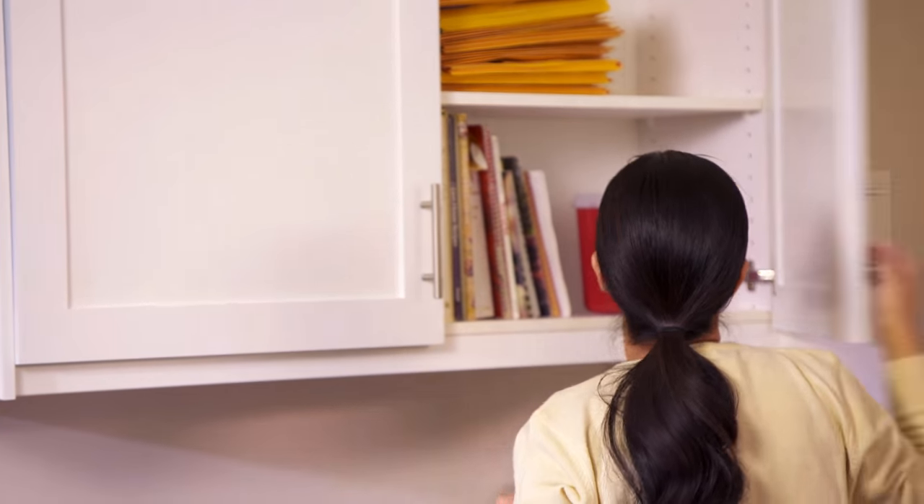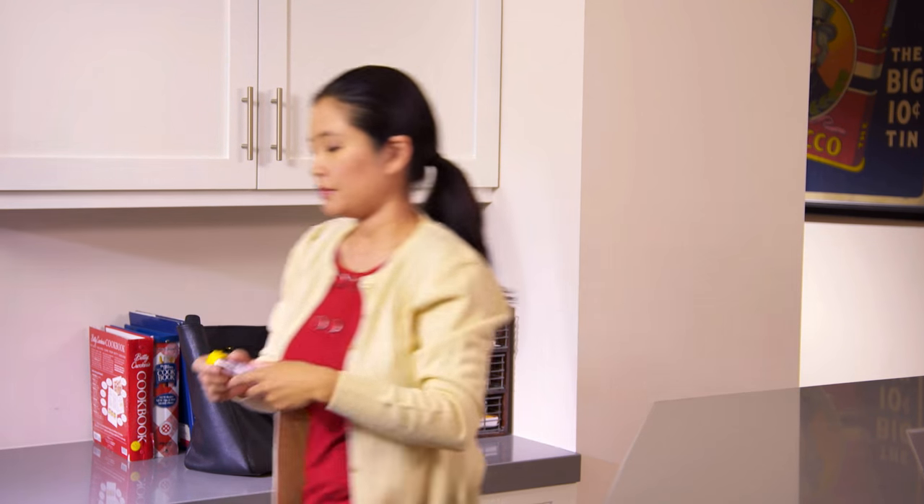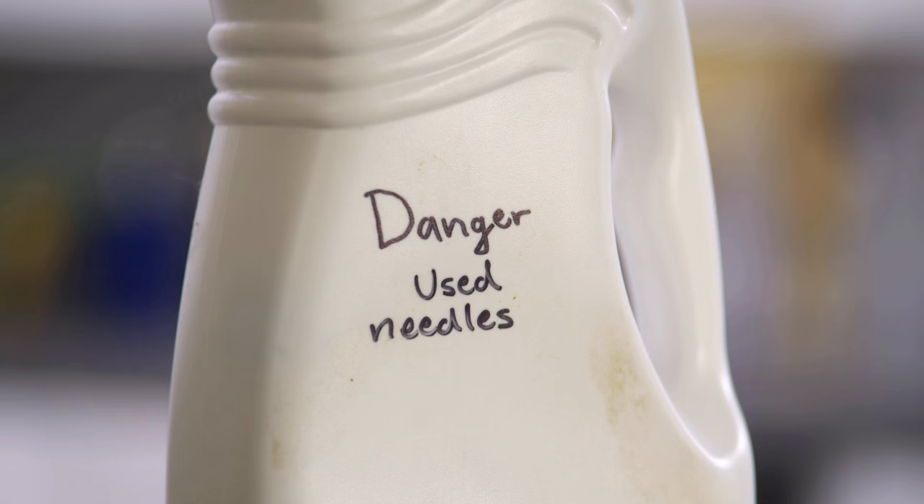Put the used auto-injector in a sharps container. If you don't have a ready-made sharps container, you can make one using a jar or bottle made of stiff plastic with a screw-on cap. One example is a detergent bottle. Label it very clearly as dangerous. Anyone who sees it will know to leave it alone. You should keep the container in a safe place, out of reach of children and pets.